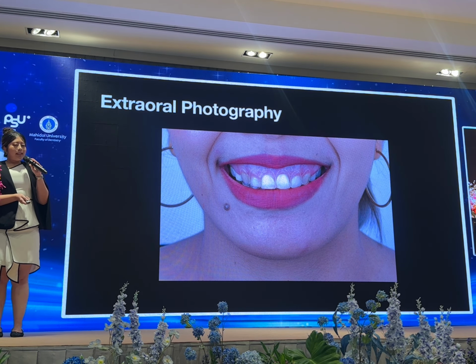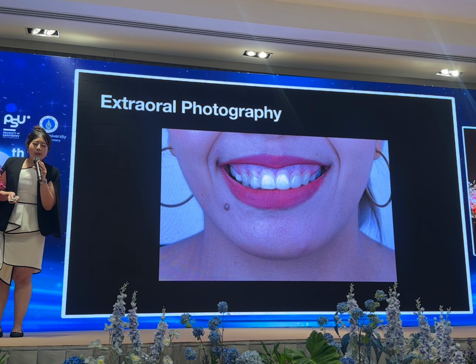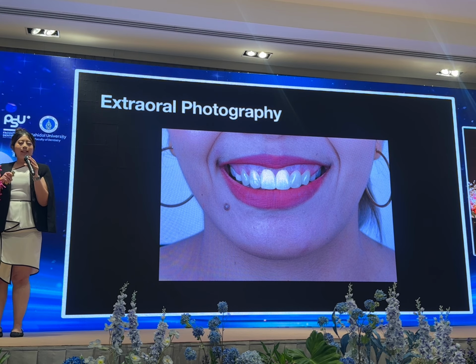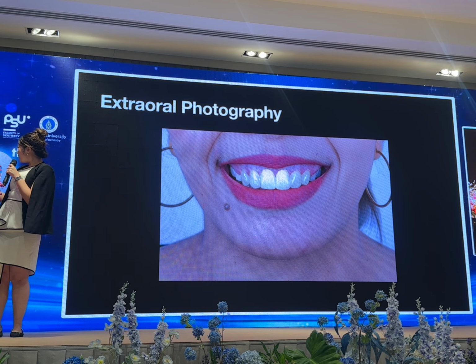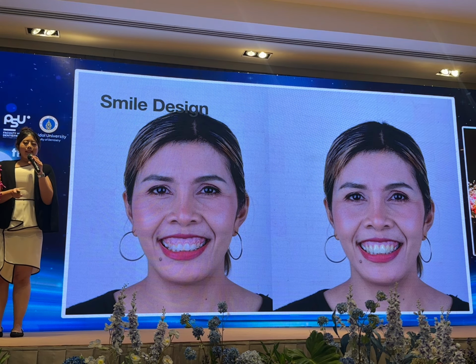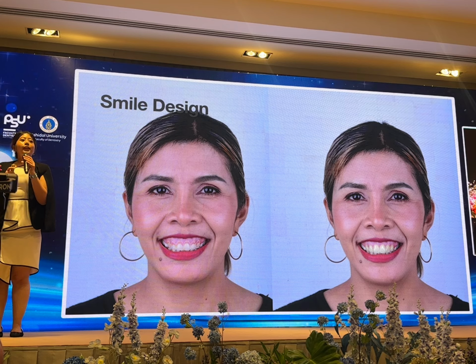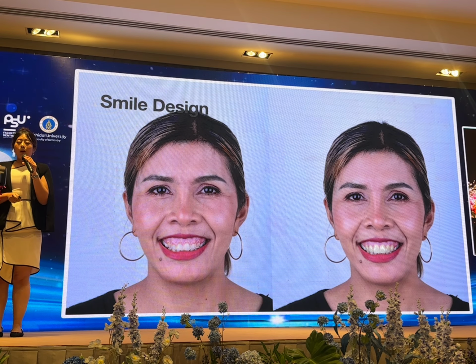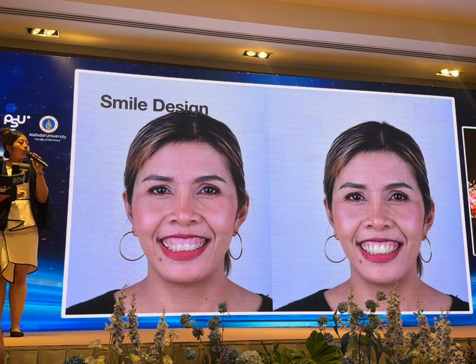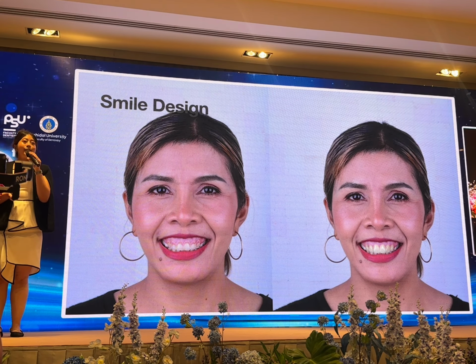I started planning with the digital smile design. So checking the tooth proportion, confirming with the lower lip line, just like the way he taught me. And look at the whole picture. But at that time, the 3D digital smile design wasn't officially available yet. So I had to work with the 2D data mostly. To be honest, there was a big struggle.